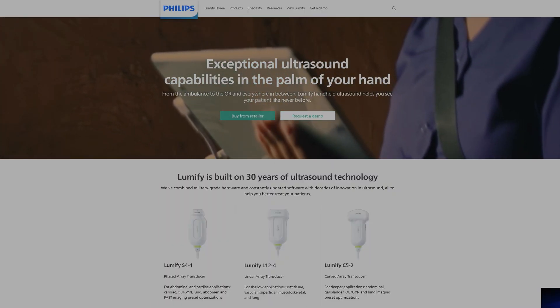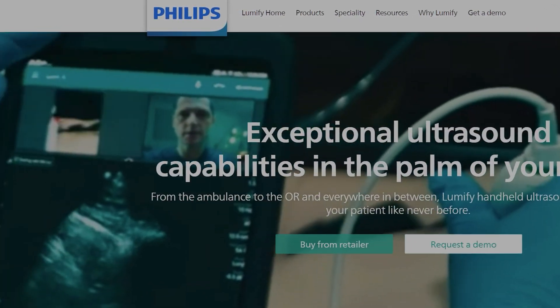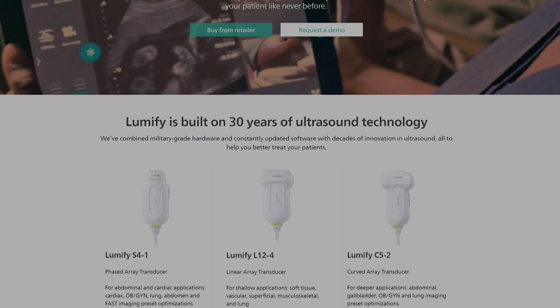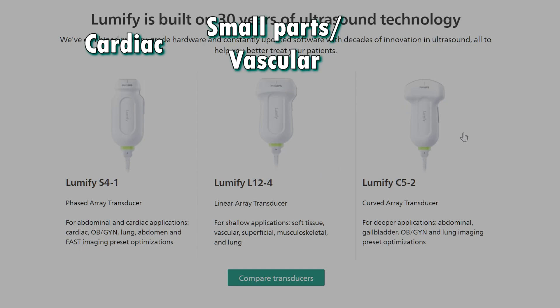Recently, I've been searching for a handheld ultrasound to do bedside paras and thoras. Starting by going to the Philips website, you can see there are three different ultrasound probes. The S4 is essentially a cardiac probe, the Linear 12 is the small parts and vascular probe, and the C5 is a body probe.